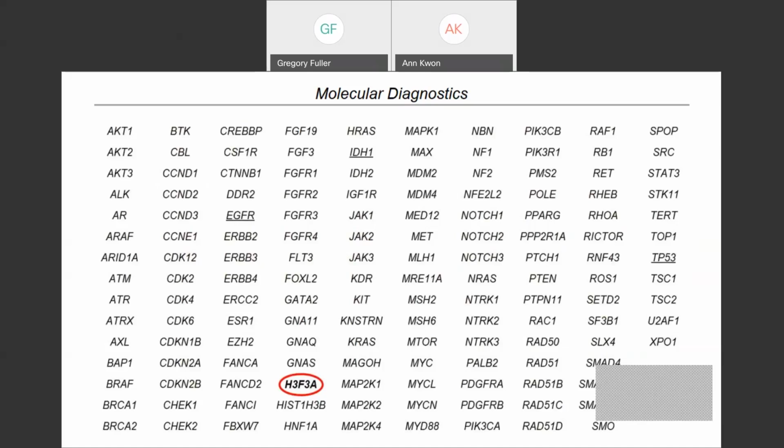Let's see, Dr. Trivedi said peripherally contrast enhancing. Okay, peripherally contrast enhancing is interesting. I think that may be going for glioblastoma. I love that Dr. Trivedi committed. You need to commit. You need to fail publicly, okay?